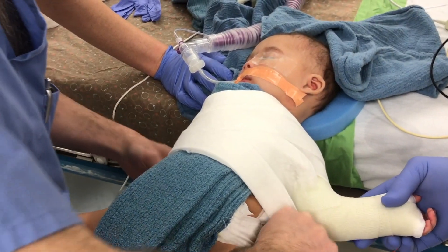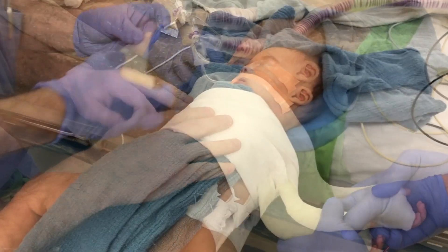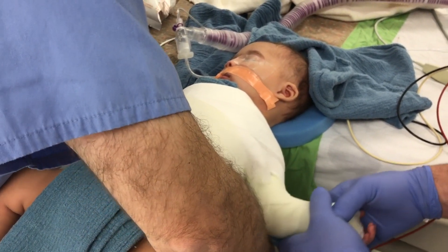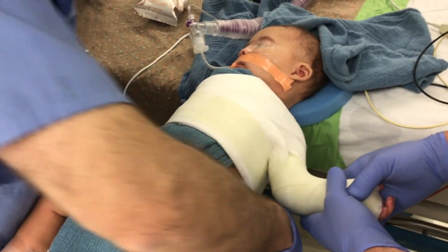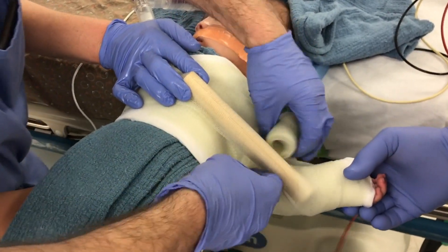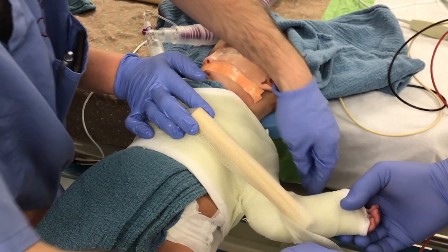Cuffs are applied to protect the skin. Up until walking age, we prefer soft cast as our casting material. When it comes time for cast removal, the soft cast can be unwrapped and is therefore less traumatizing to the child than using a cast saw. A bar is used to maintain the position of maximum external rotation and as little abduction as is required.